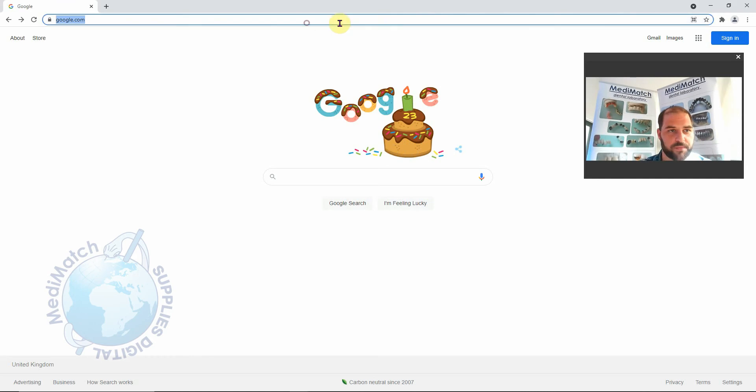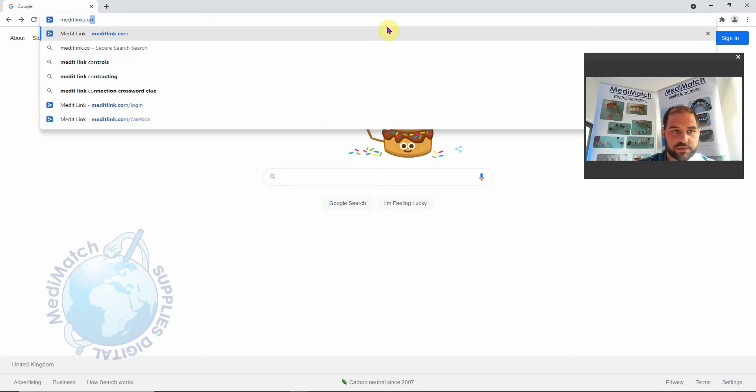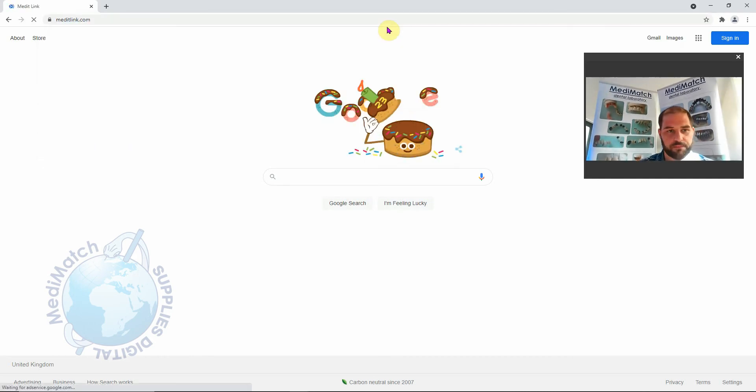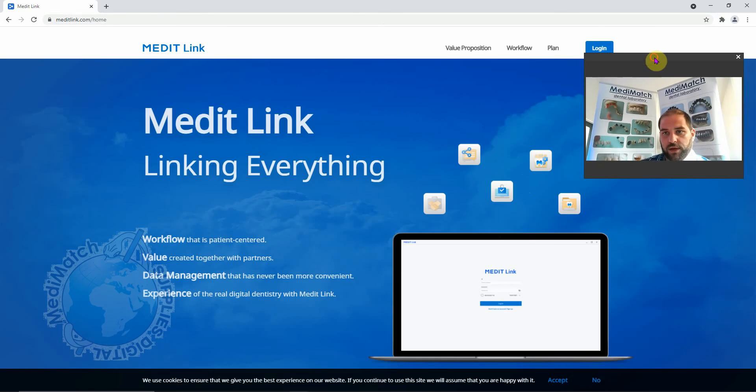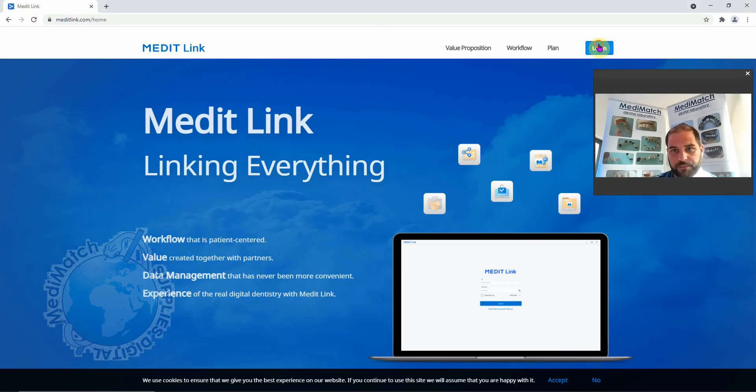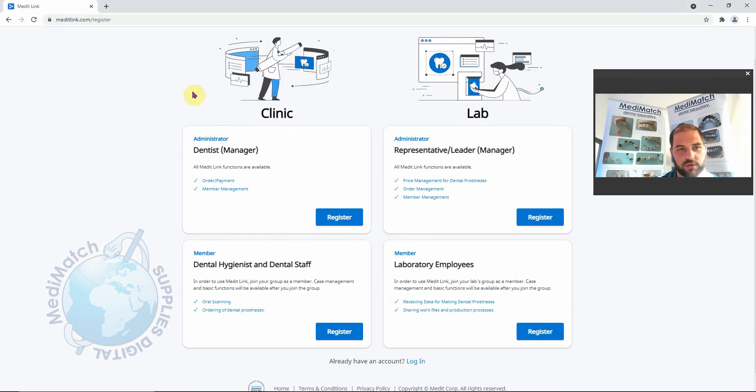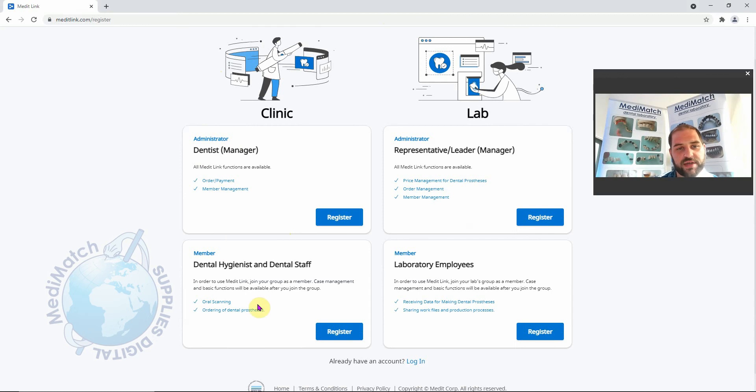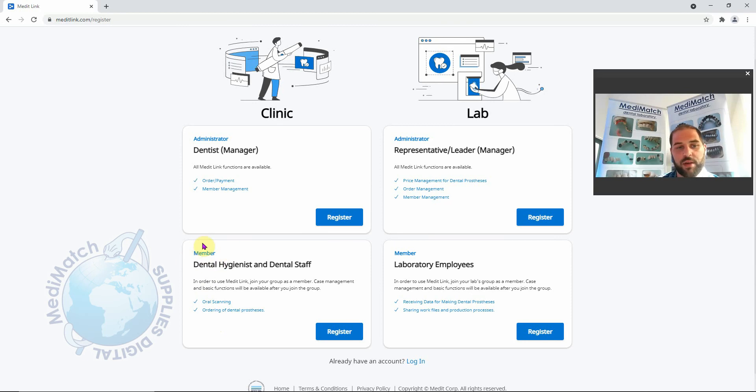I've opened up a web browser here. I'm going to go to meditlink.com. I'm going to click this login button up here and click don't have an account. You've got a couple of options here on the clinic side: an administrator account and a member account. If this is the first time you set up a Medit scanner and it's the first one in your clinic, then set up as an administrator. If you have subsequent scanners or members of staff who'd like their own account, you can set them up as a member and give them access to your clinic. We're going to go ahead and do administrator.